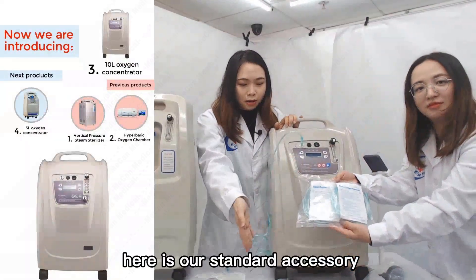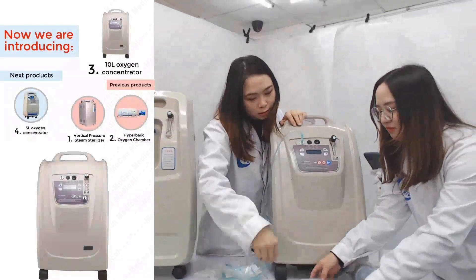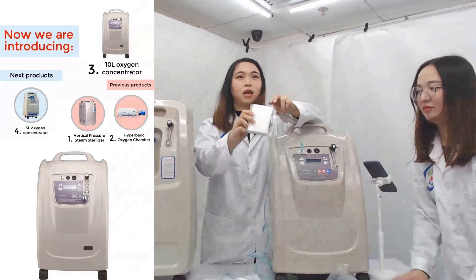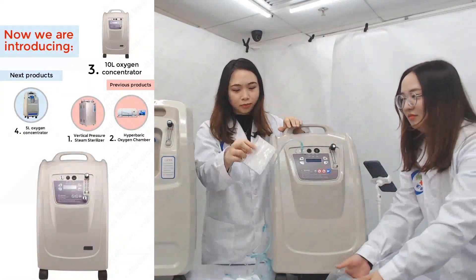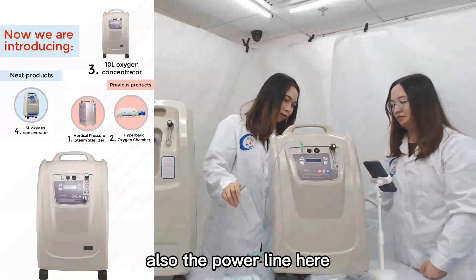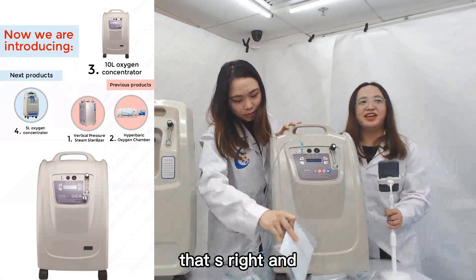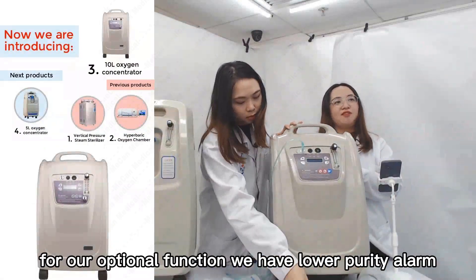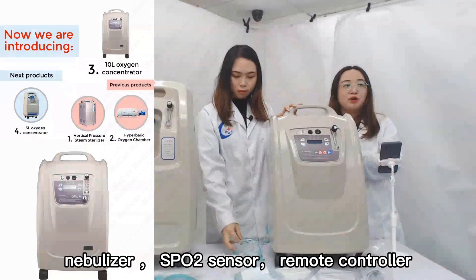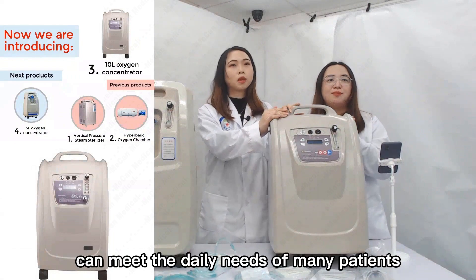Here are the standard accessories. You can see two nasal cannula pipes, a dust filter, a HEPA filter, a humidifier bottle, and a power cord. For optional functions, we have a lower purity alarm, high and low pressure alarm, vaporizer, SPO2 sensor, and remote controller. The standard configuration can meet the daily needs of many patients.